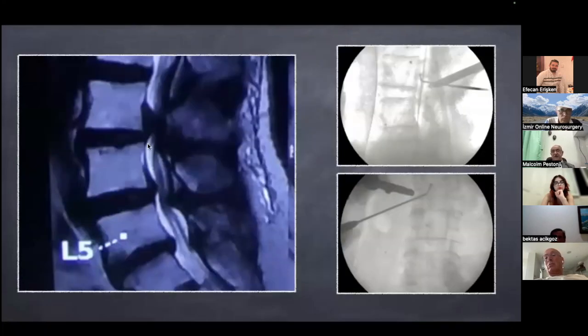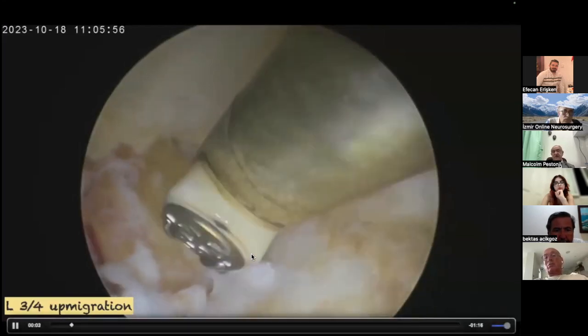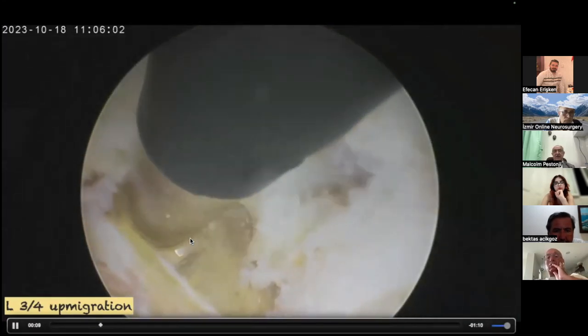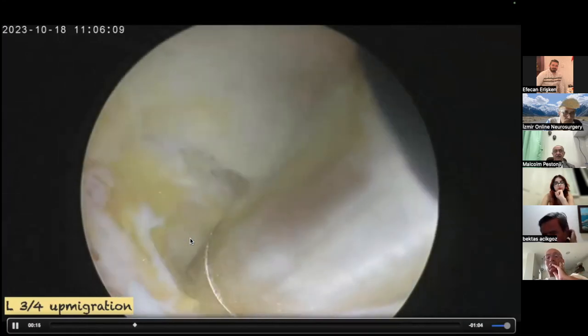See this patient with a huge up migration over here. See these images, and you can understand what Para-UBE can reach, can achieve without fear, without worries. So easy to do. See this. At L3-4, that same patient's up migration, there's a lot of fat in the axilla, slowly going by the side of the root, burning out that fat. I can see the vein beside the root, so I know I'm safe.